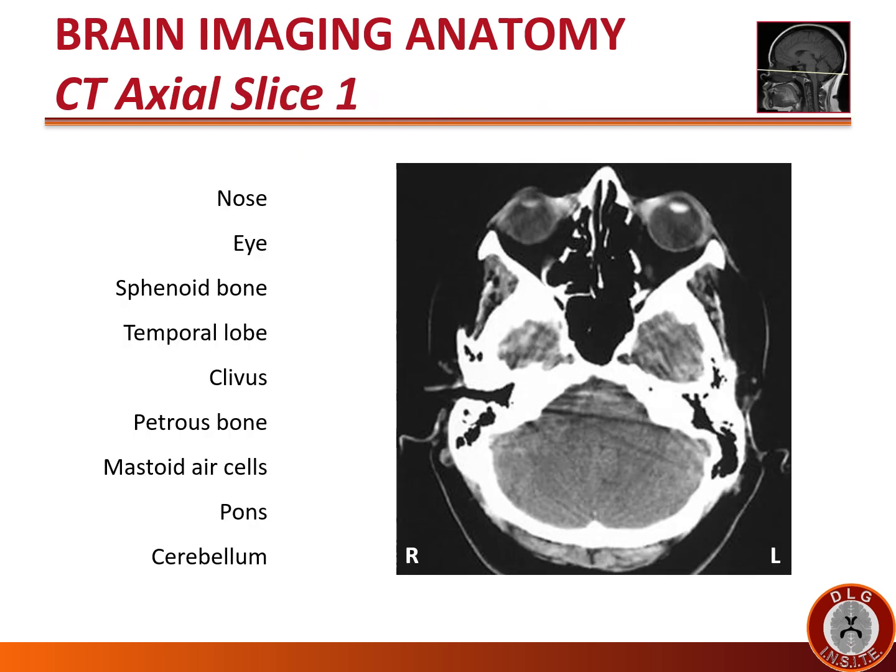We will now view multiple CT scan axial images in the same patient demonstrating normal anatomy. In the upper right corner of each slide is a sagittal MRI showing you the level of the slice depicted. See if you can identify the structures listed on the left before proceeding.